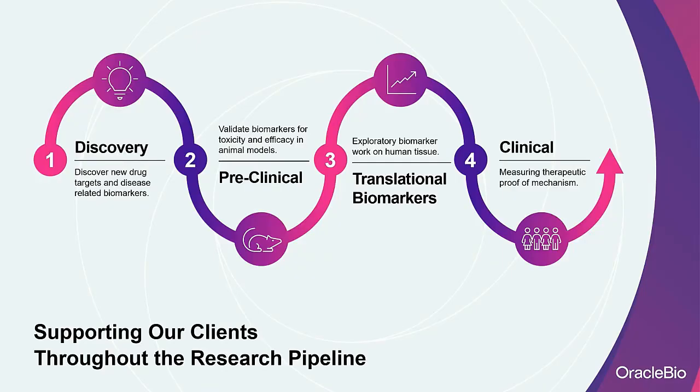We cover all aspects of the R&D pipeline, starting with target identification in early discovery, through to preclinical animal model outputs, exploration of translational biomarkers, and then finally covering image analysis for live clinical studies.